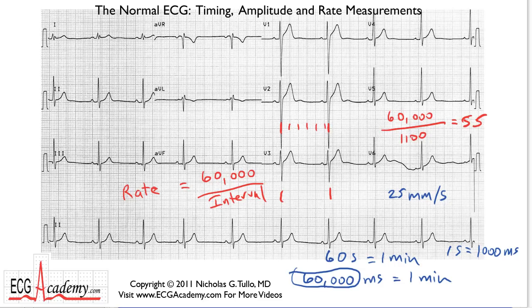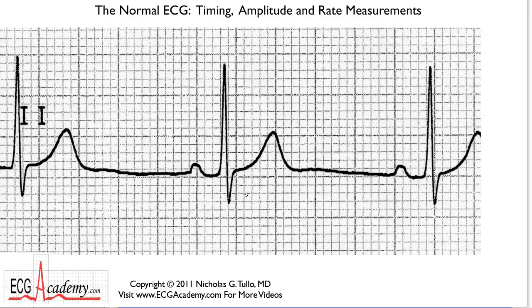You can count backwards and forwards as well. Here's a P wave that lands on a heavy line, and you can count backwards: 200, 400, 600, 800, 1000, 1040 — and then plug that calculation in. But there is an easier way.